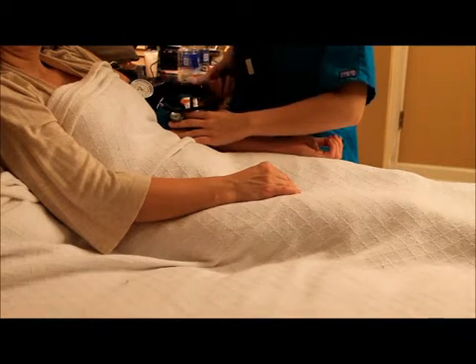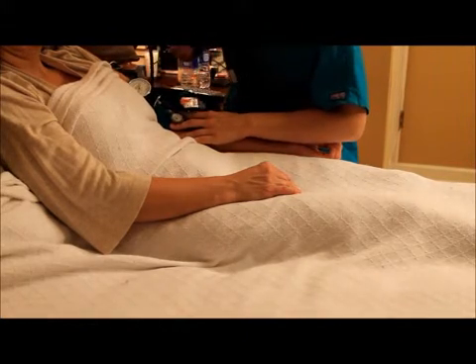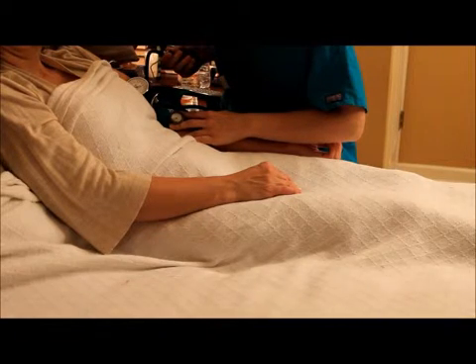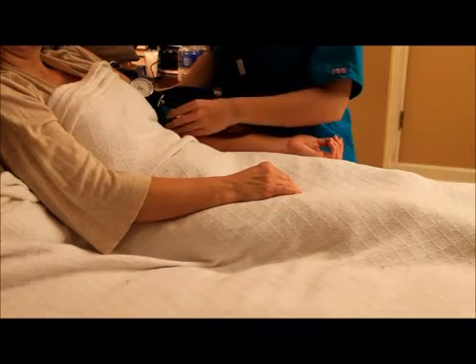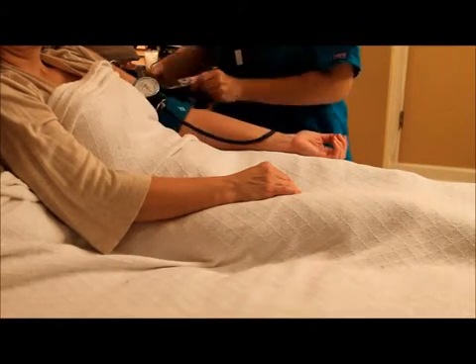Next, you will inflate your blood pressure cuff to between 160 and 180 millimeters per mercury. After reaching that point, slowly deflate your blood pressure cuff until you find the systolic reading and the diastolic reading. The systolic reading is the first strong beat that you can hear. The diastolic reading is the last strong beat you can hear. Then, remove the blood pressure cuff and record your results. The systolic number goes over the diastolic number.